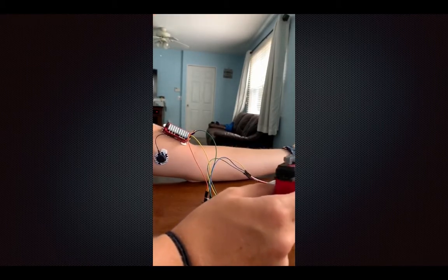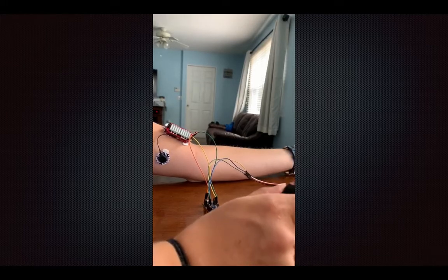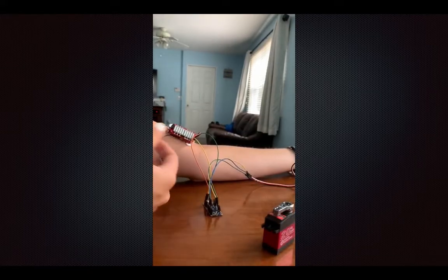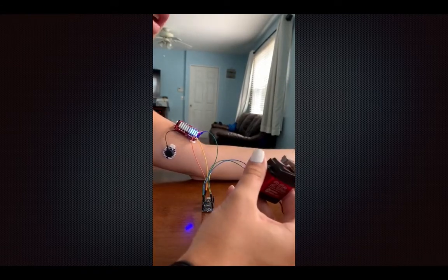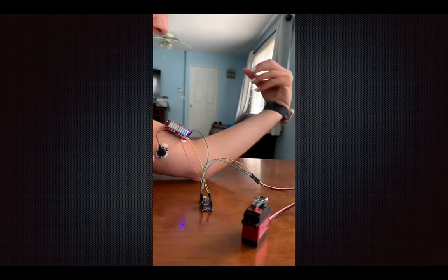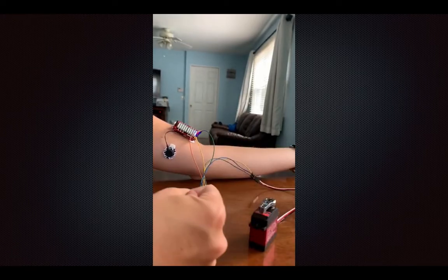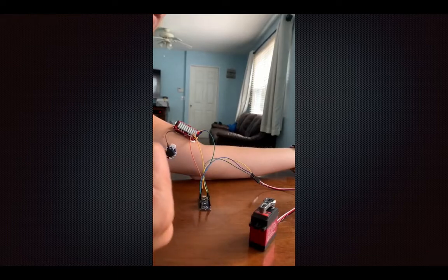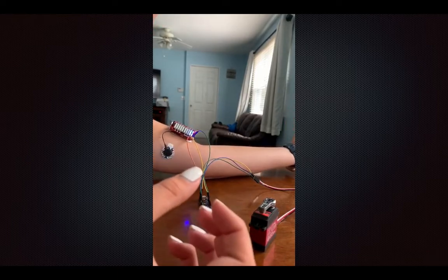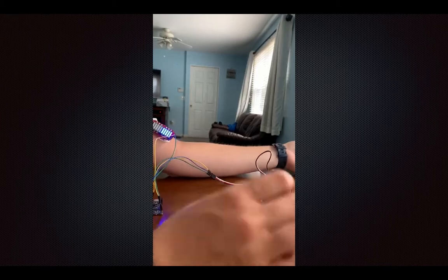So we need 4 to 6 volts in order to make the motor move. And we were only getting about 1 volt. So if we had more time, we would have fixed the wiring and gotten this to move. And when we would do the muscle flexing, the motor would move. And once the motor moves, it would allow us to pull the copper wires that we put inside the prosthetics. So that would be the fingers. So that would be what allows you to clench your hand like this or release. But yeah, we didn't get to finish that because we didn't have enough time to correct the output.